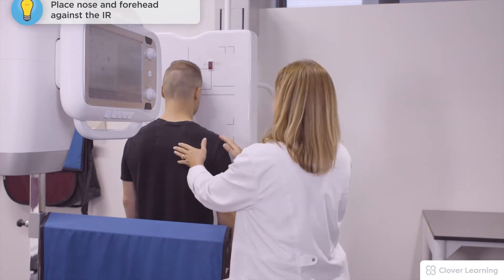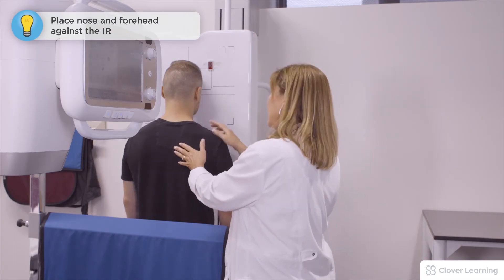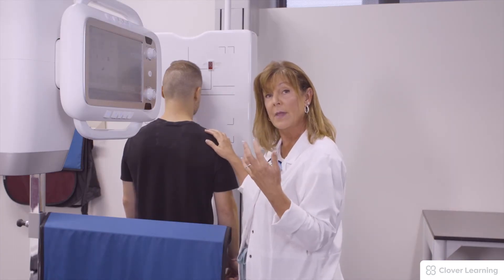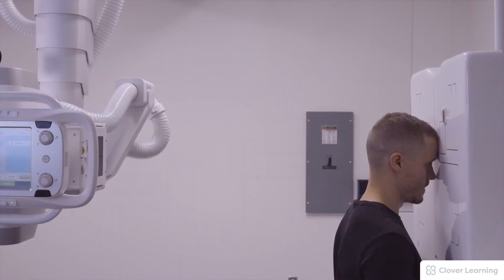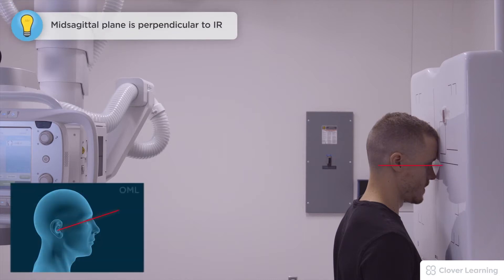For the PA view of the skull I have my patient standing at the upright bucky tray. It can also be done on the table top or with the patient sitting in a chair. My patient is upright and I have placed his nose and his forehead against the IR. The mid sagittal plane is perpendicular to the IR.